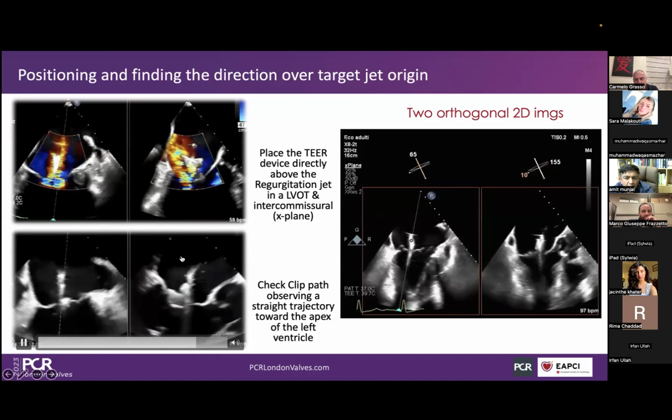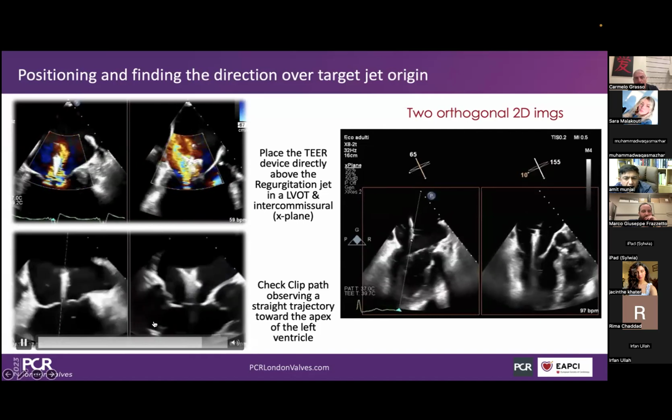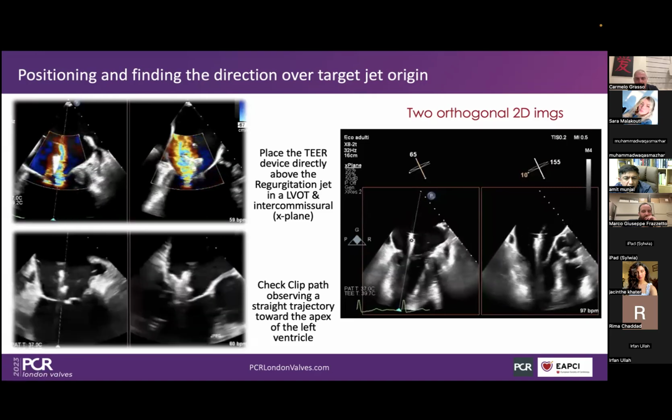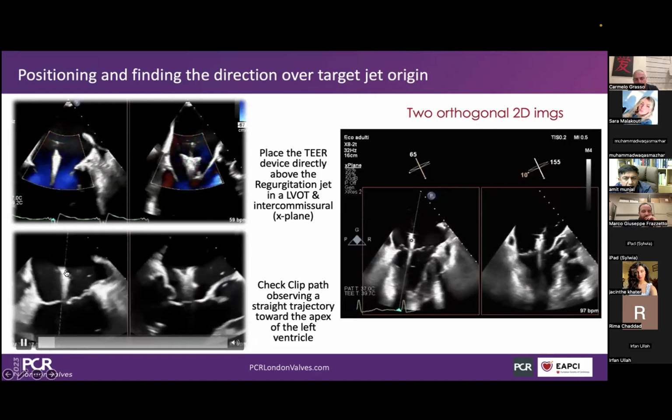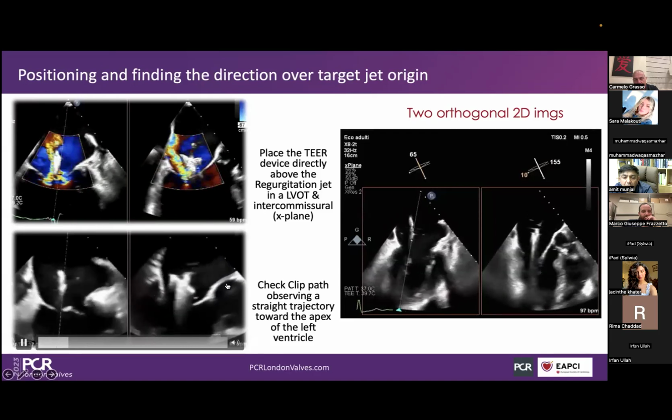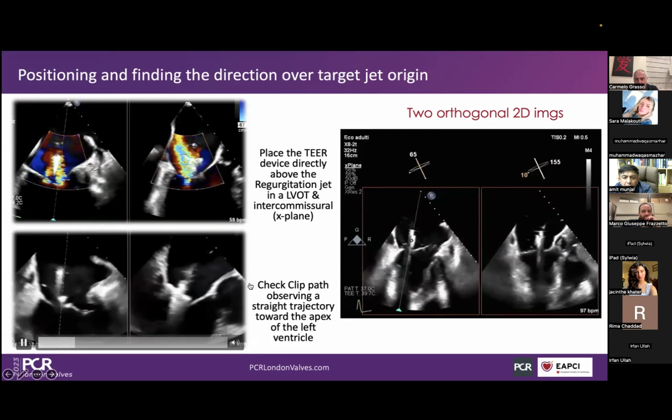The trajectory means that when we go up and down with the device, both with the Pascal and with the MitraClip, we have to go straight and perpendicular, both in the two-chamber view and in the LVOT view.